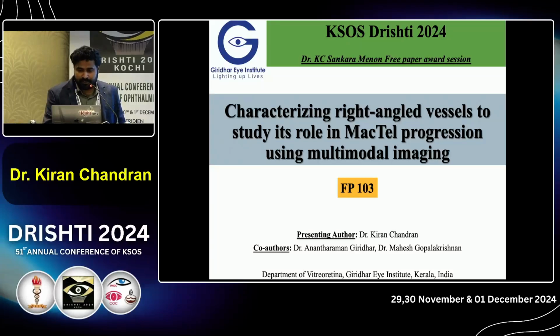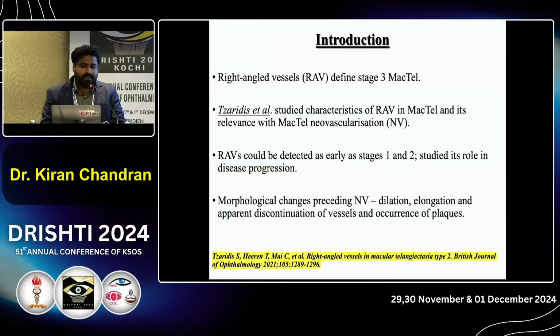Good afternoon. Today I'll be talking on characterizing right angle vessels to study its role in MacTel progression using multimodal imaging. So right angle vessels have been defined as per the Gass-Blodi clinical staging into stage 3 MacTel. Recently, a lot of interest has gone into using multimodal imaging, specifically OCTA, in characterizing the vascular changes in MacTel.